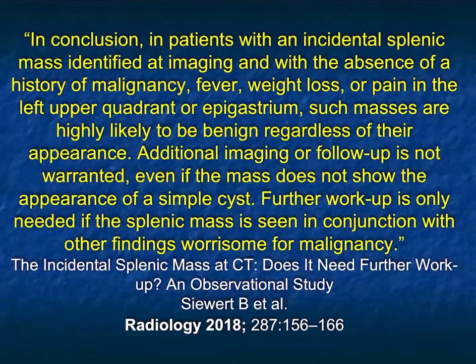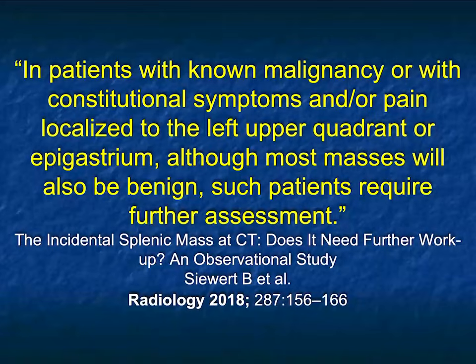When patients have fever or weight loss or other symptoms, you got to aggressively think about the possibilities. We've looked at many different cases, some challenging cases you'll rarely see. We talked about some of the difficult differential diagnoses. And again, I think if you work really hard, you'll be able to do really well.